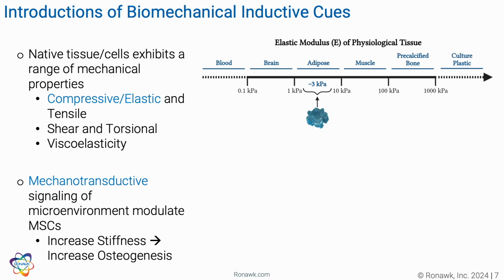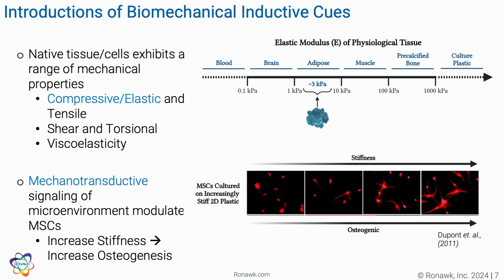That will emulate adipose tissue, and that is due to our internal interest in mesenchymal stem cells, specifically adipose-derived mesenchymal stem cells. That is very important because, as you see in this image, depending on the stimuli you're giving your cell is how that cell is going to behave. If you're planning on developing new therapies, a cell that doesn't behave as it does naturally will give you false positive data.